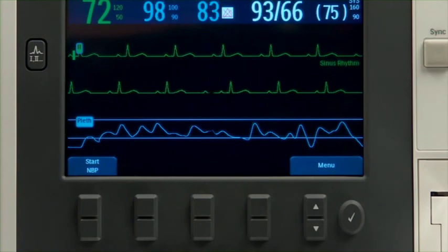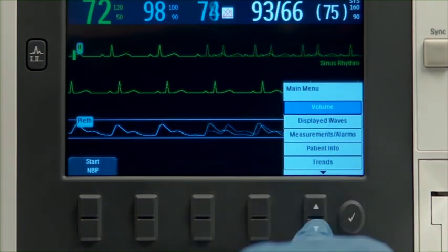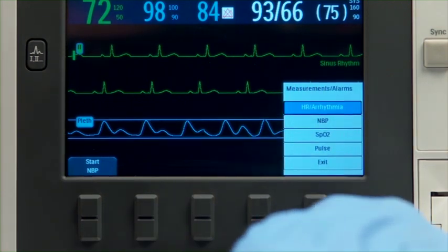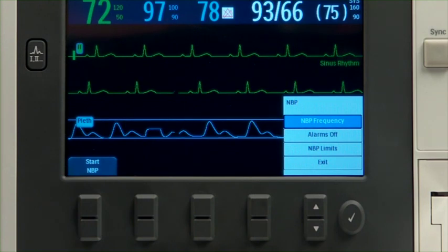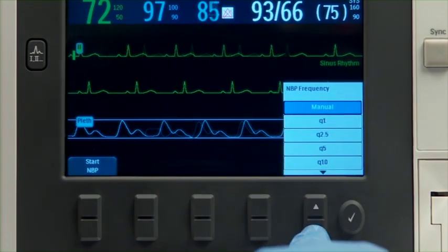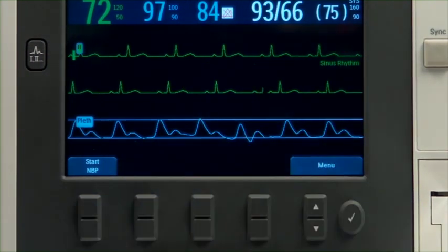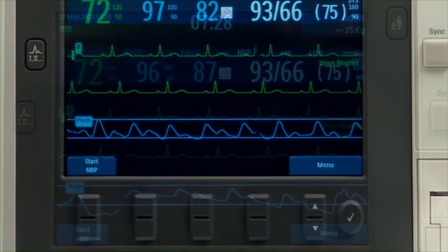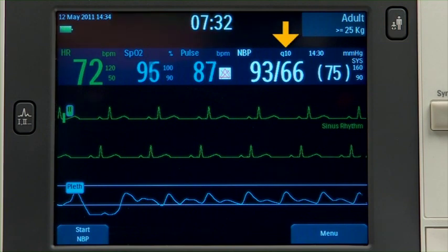To schedule automatic NBP readings at regular intervals, press the Menu Select button. Navigate to Measurements Alarms, NBP, NBP frequency, and press Menu Select. Select the desired interval and press Menu Select again. Automatic measurements begin based on the interval set, and the automatic time interval appears on the screen.